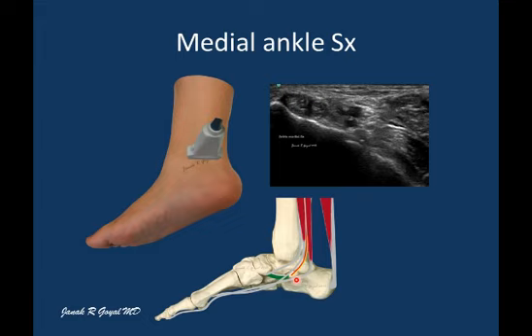Now to examine these tendons along the long axis plane, the transducer is turned by 90 degrees and these tendons are examined along their long axis starting from the posterior tibia and going up to the attachment of the posterior tibial tendon, and examine the tendon of the flexor digitorum longus and flexor hallucis as they move deep into the plantar aspect of the foot.